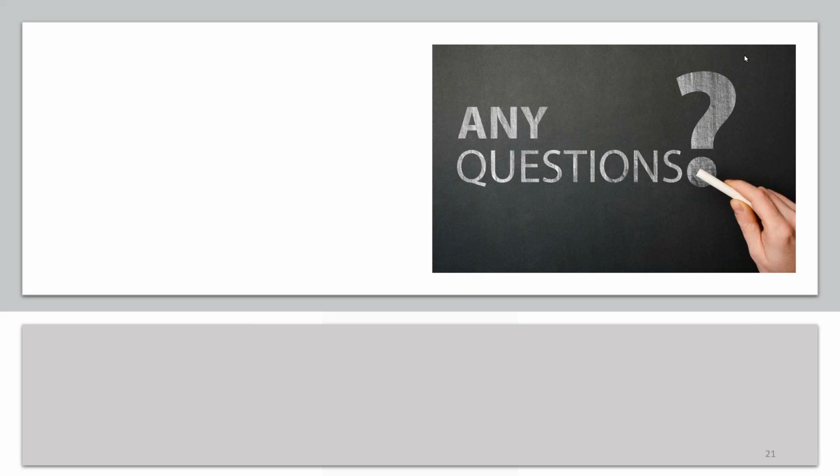I would recommend, again, that you talk to a toxicologist about this material and do your risk assessment, look at the intended use, what the essential performance expected of this device is, and then go to what kind of testing we would need to do to prove that to somebody. That's the best I can do for you.